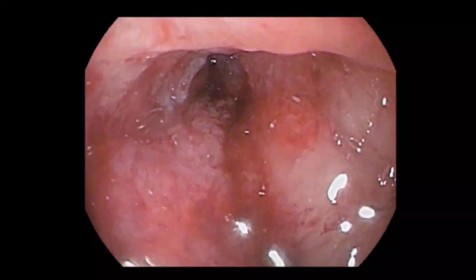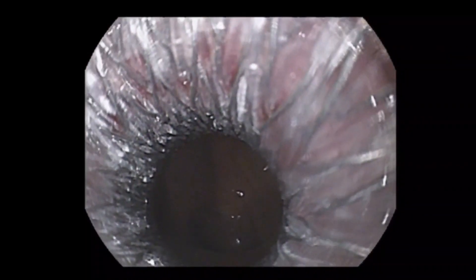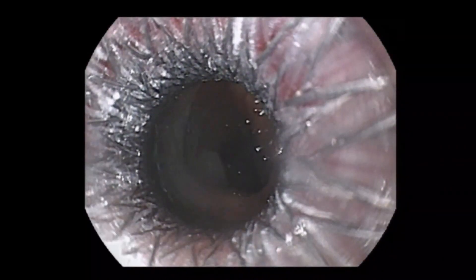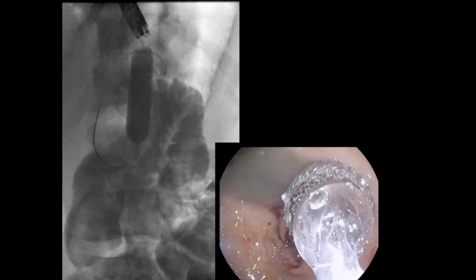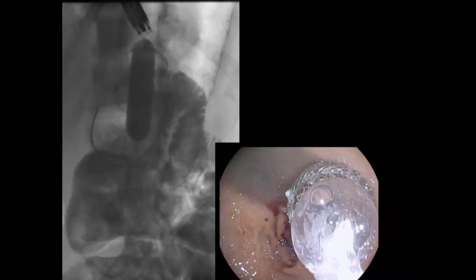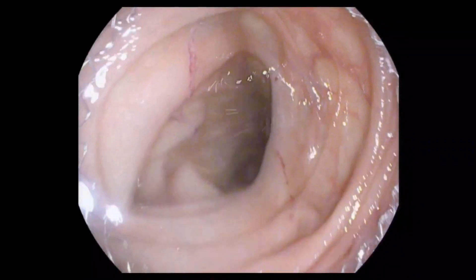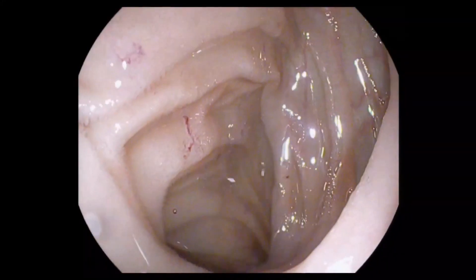The echoendoscope was then exchanged with a forward-viewing gastroscope. The LAMS flanges were seen in appropriate position in the gastric pouch, proximal to the stenotic anastomosis. Using a wire-guided balloon, the LAMS was dilated to 15 millimeters under endoscopic and fluoroscopic guidance. This was done to shorten time to improvement in symptoms of gastric outlet obstruction. Following dilation, the endoscope was advanced through the LAMS into the small bowel, revealing healthy jejunal mucosa.